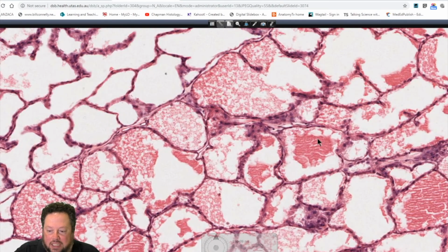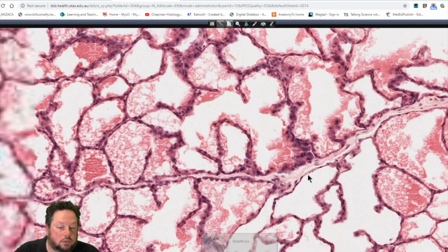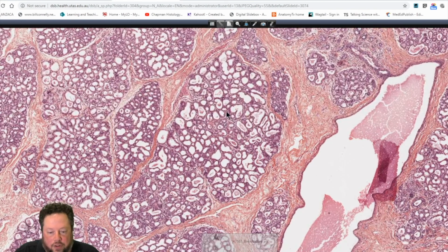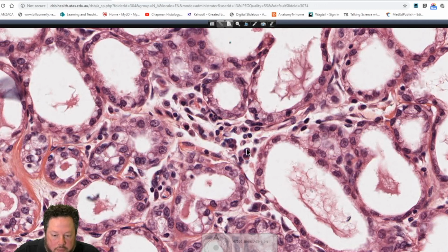So sometimes you can find some of those plasma cells out there, and they're usually characterized by being very basophilic in staining. So let's have a look at this one. Yeah. Can you see these very basophilic staining cells? These are the plasma cells, and they're producing the immunoglobulins, which are being passed on to that early milk.